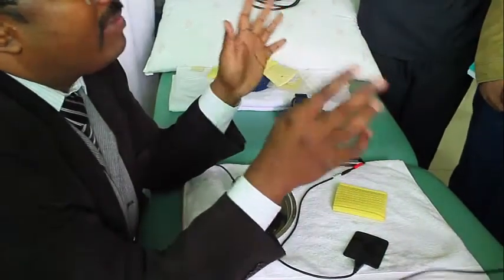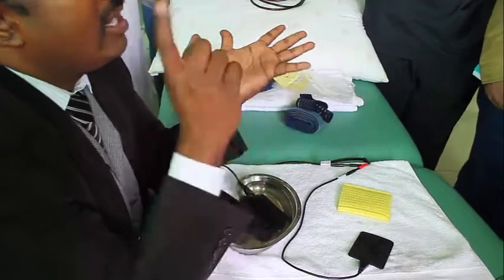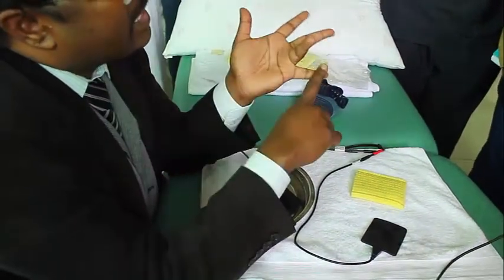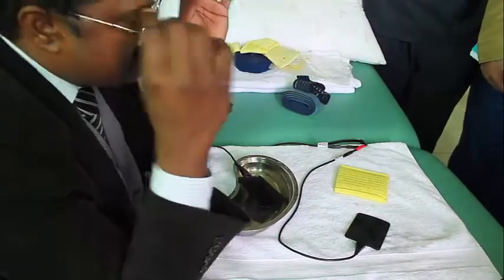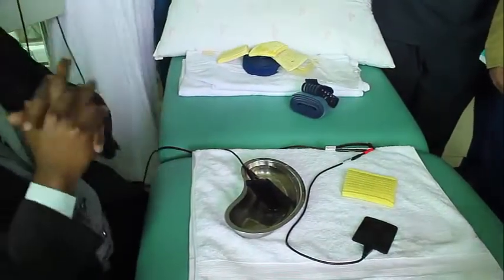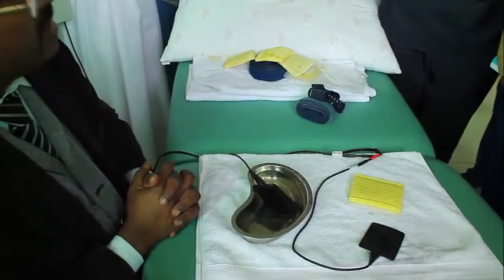But the most common ones are either water or gel. These are the two common varieties. Shave and scrub are not done very commonly, unless you require more treatment durations. When the patient is going to come to you, then you do it.